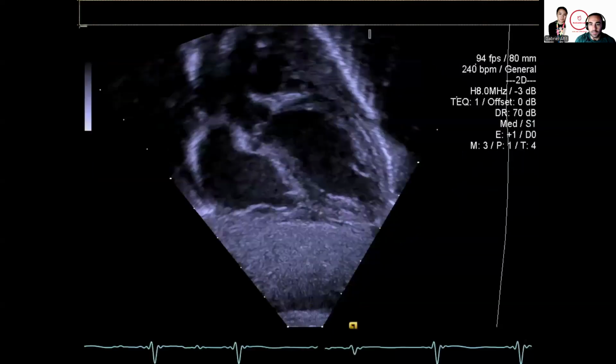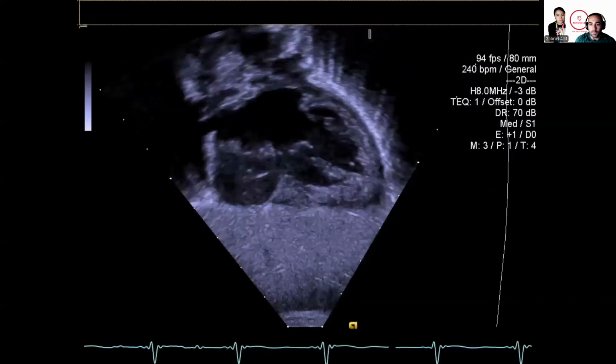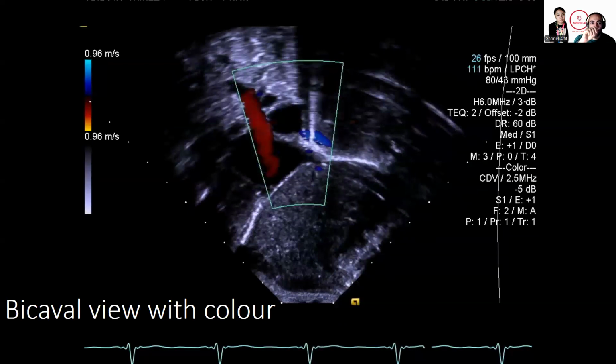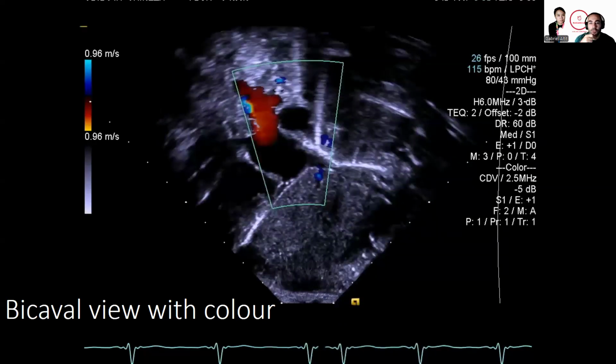I'm going to skip this view. So we did this already. This is another sweep from anterior to posterior in the subcostal area. And now we're going to turn the probe. This time, instead of being parallel to the costal margin, we're going to go 90° to that.